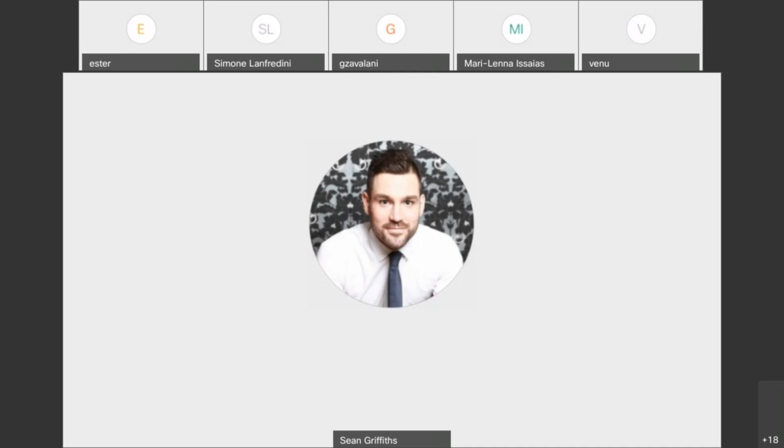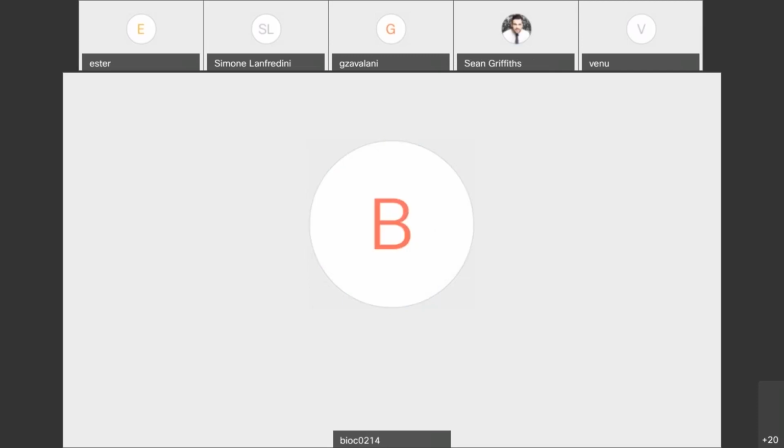As with the training we had last time, we're going to do a screen share of the software itself, so we can get immersed in what we're doing. I've just remembered there's also a chat window, so because there are so many of you on here, if you don't want to interrupt or voice a question in front of so many people, you can add it to the chat. I'll try and treat this a bit like a webinar and keep checking the chat to see if there's any commentary.